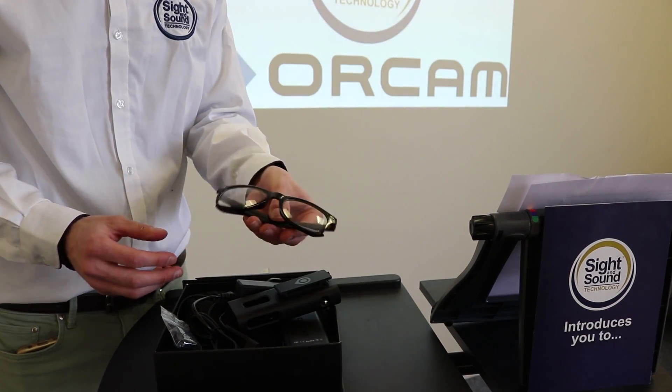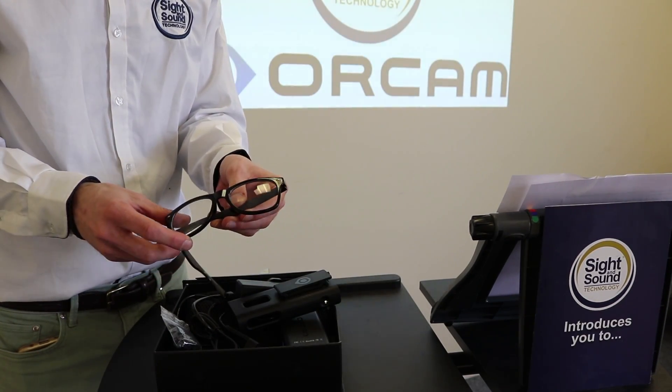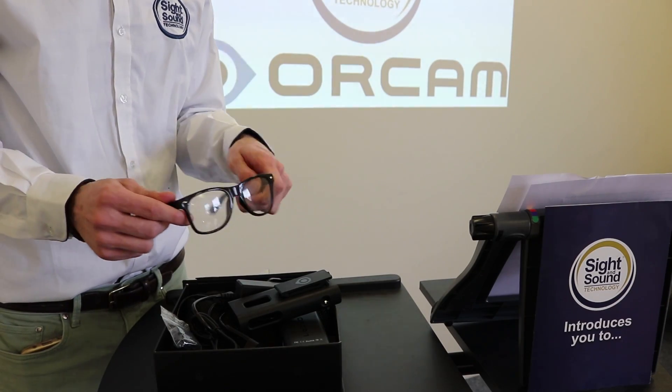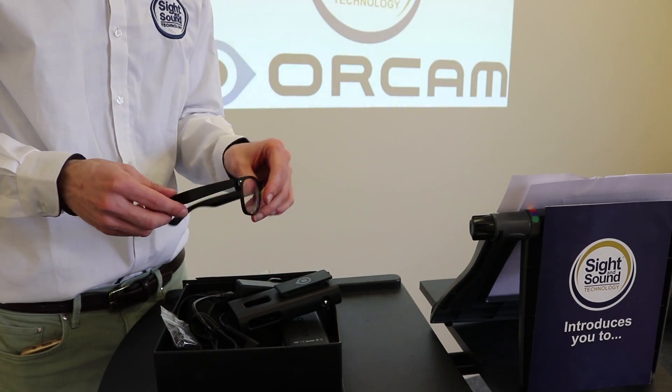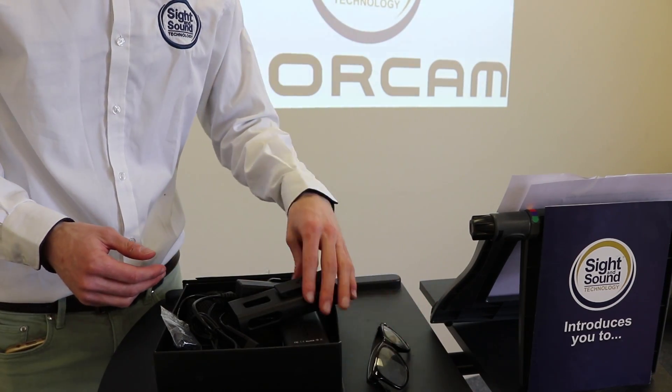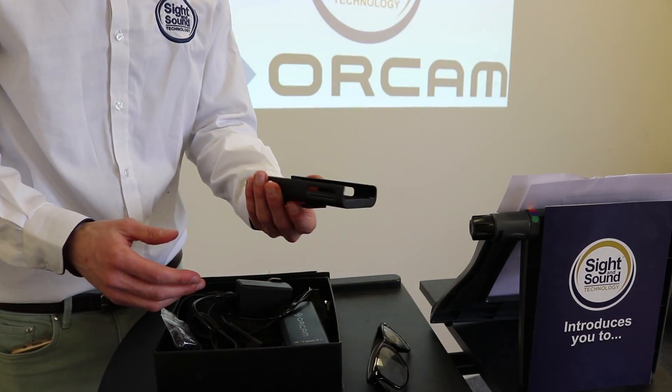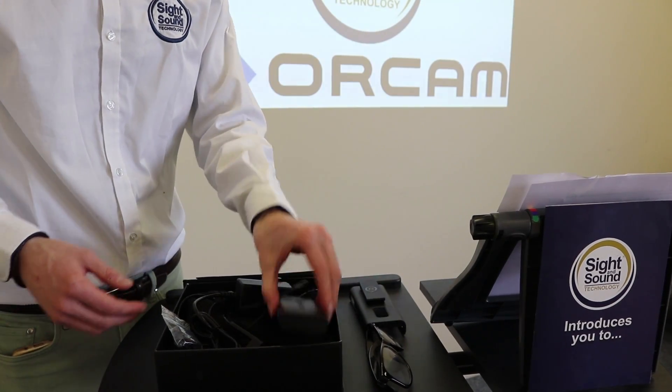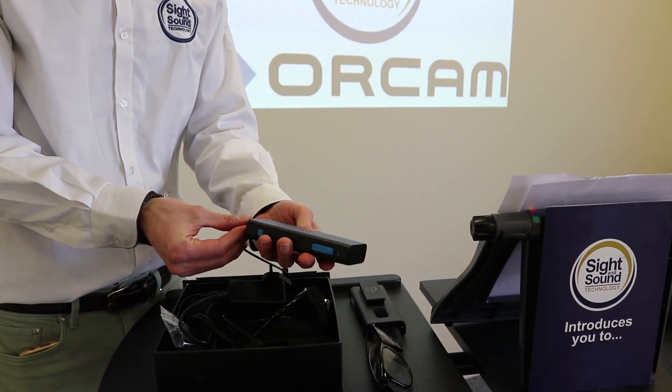So we've got a pair of glasses, these are just generic glasses, you don't have to use these. We include them anyway just in case you don't usually wear glasses. You do of course need something to mount the camera onto, that's why we include them. But yes you can use your own glasses, I'll show you how to mount them in a second. We have a protective case so you can clip it onto your belt. This is the base unit or the control panel.